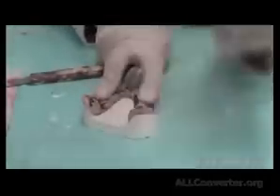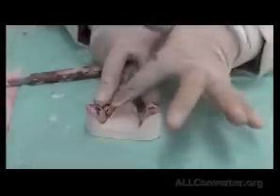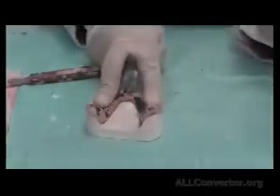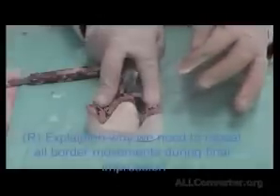We ask the patient to open widely, to go with his mandible to the left and right. We ask him to mimic swallowing or say ick forcefully. This would raise this area. And then move the tongue from the left to the right and to the front and to the back. This will mold this area. So all of these movements, we do them in the impression as we have done them in the border molding. We have many students asking that we have already done those movements in the border molding.